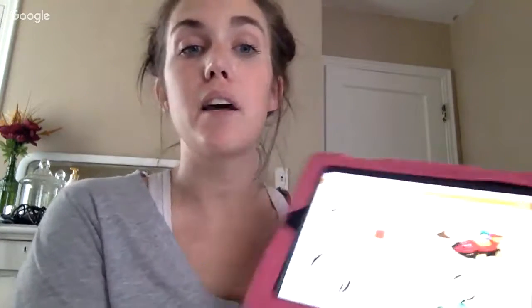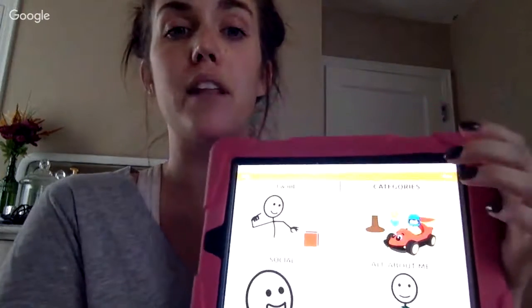You can also do a TouchChat which is even more basic. A lot of times when we start using TouchChat, we use one icon and we pair that during a mand training session. For instance, the home page will have one icon rather than the four, generally an edible, something like Cheerios. The staff member implementing the mand training session will have out the TouchChat with the single icon, the child will press Cheerios, then the staff member will deliver the Cheerios, and the TouchChat itself will give that language back to promote that language with the child, so they hear Cheerios as they're receiving it.